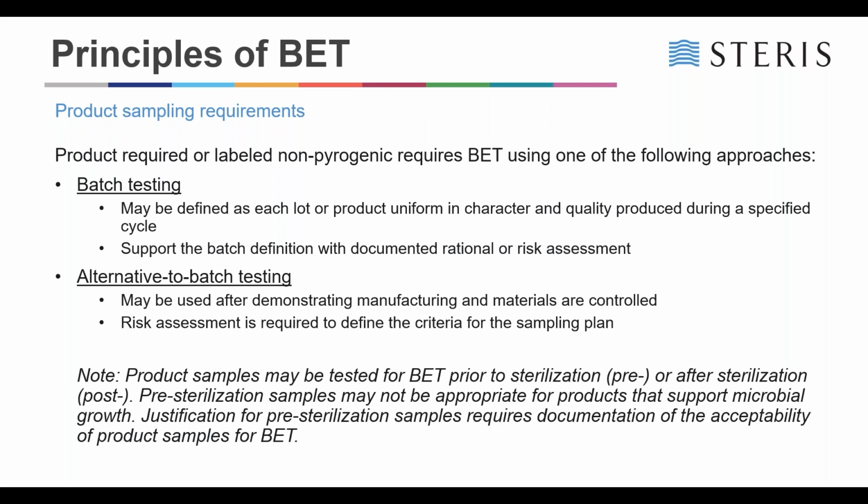In addition to that, samples are typically analyzed post-sterilization. However, in some cases, pre-sterilization may be acceptable for products that don't support microbial growth.